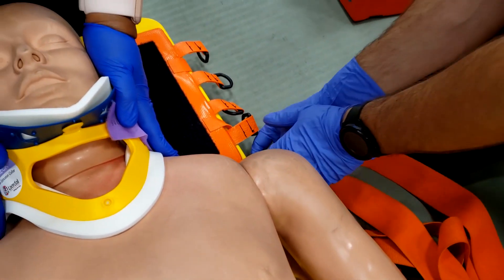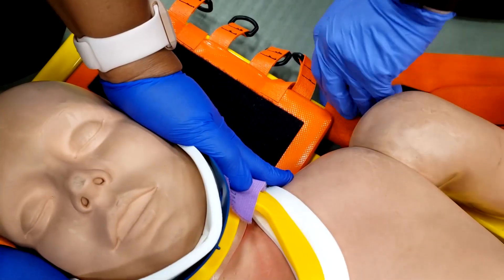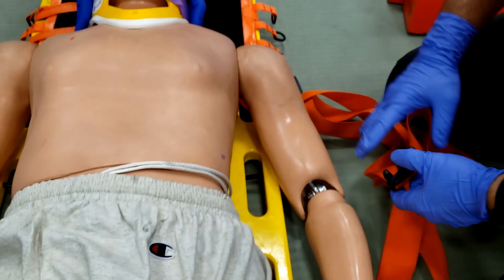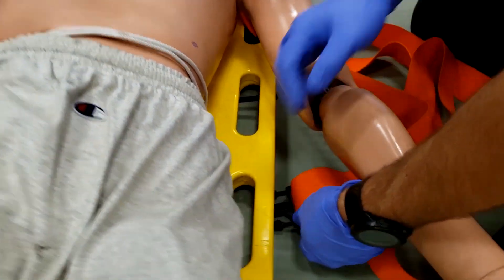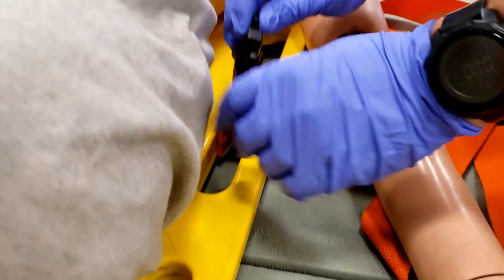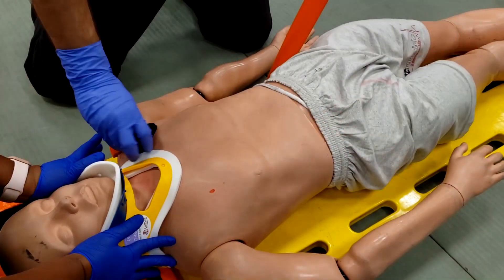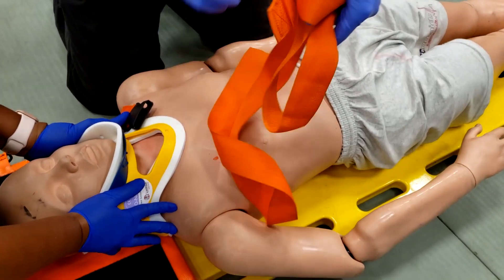Begin securing the patient by feeding the female buckle from under the board, placing it on the upper left or upper right side of the chest. Skip down to about the third loop and then feed the male buckle from under the board and place it diagonally across the patient's chest towards the opposite shoulder.